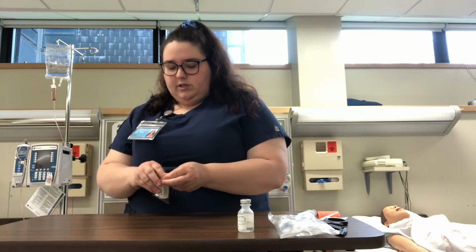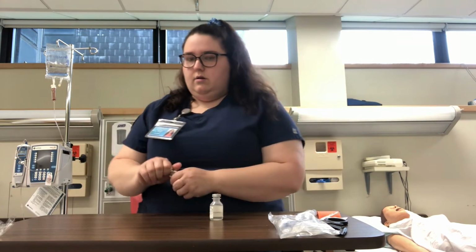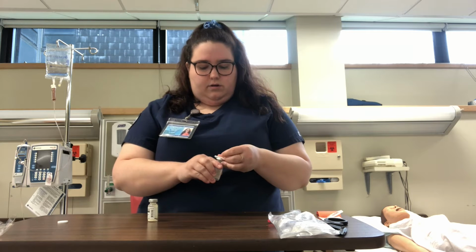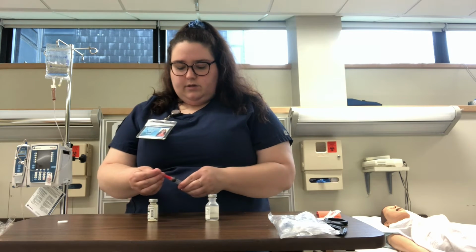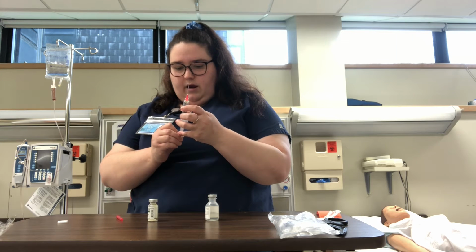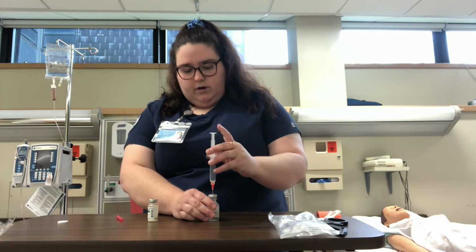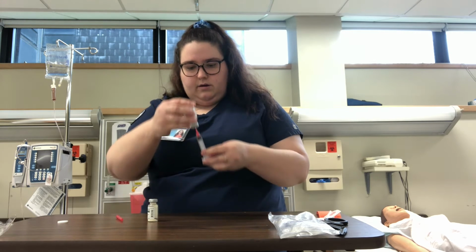Open up my medications. And then this one I'm going to clean with an alcohol swab because it's already been opened. Take my syringe. I'm going to take up 5 of air. Put it in my normal saline.